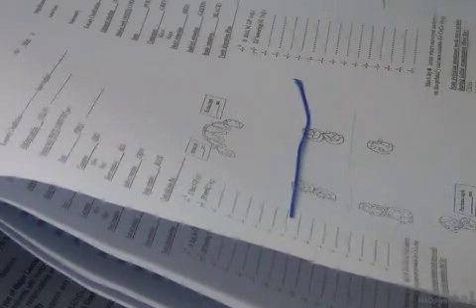If I'm talking about this fulcrum line, I have a rest here and a rest here to prevent rotation. These are not principal fulcrum lines. The principal fulcrum line is this one, the last one. But these are fulcrum lines, lines running through the rests. These 2 posterior rests are preventing them. This is the principal fulcrum line, and these anterior rests are preventing the rotation there. Okay? This is called quadrilateral support. 4 rests are present, 2 on each side. For these, I don't need to add components for indirect retention.